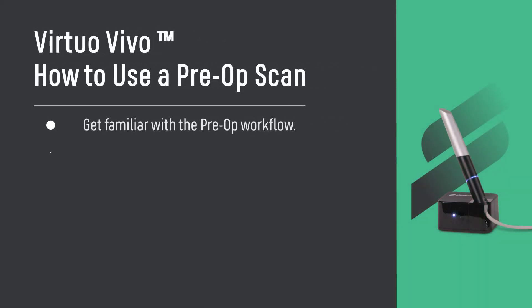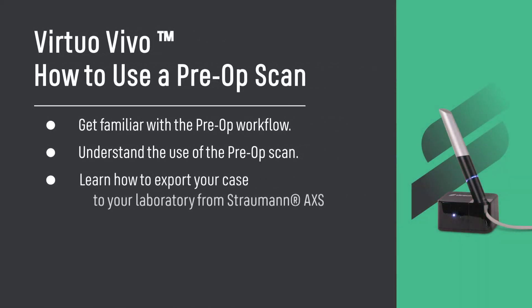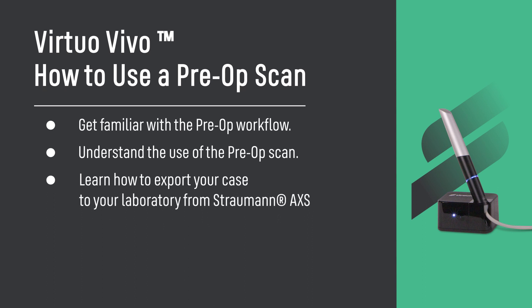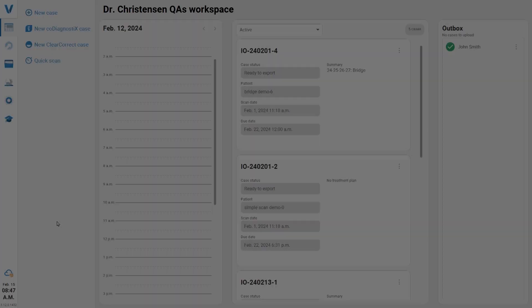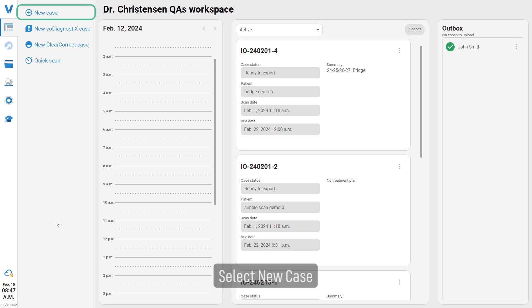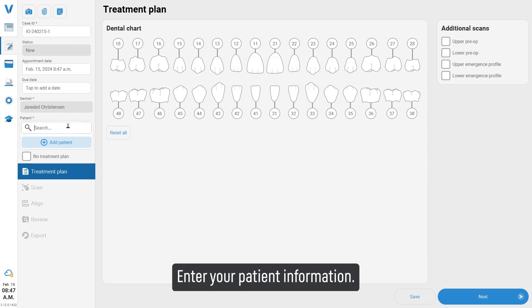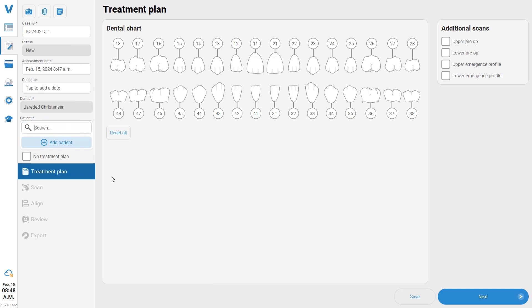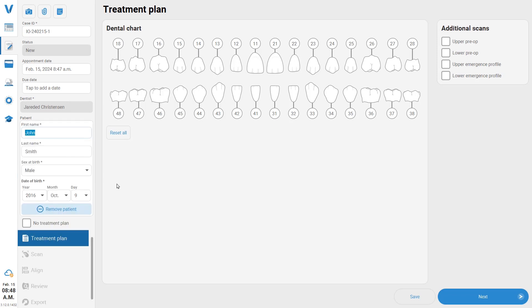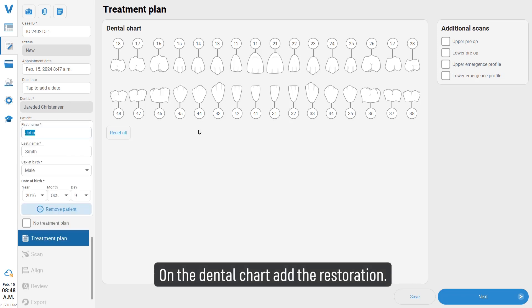Virtuo Vivo: how to use a pre-op scan. Get familiar with the pre-op workflow and understand the use of the pre-op scan. Learn how to export your case to your laboratory. From Straumann Access, select a new case, enter your patient information, and on the dental chart add the restoration.